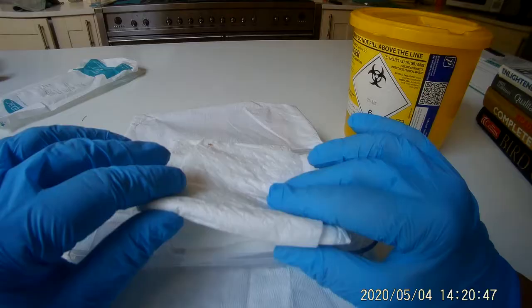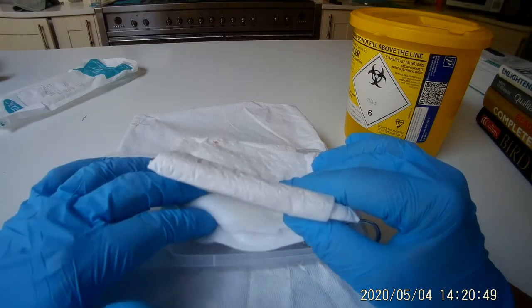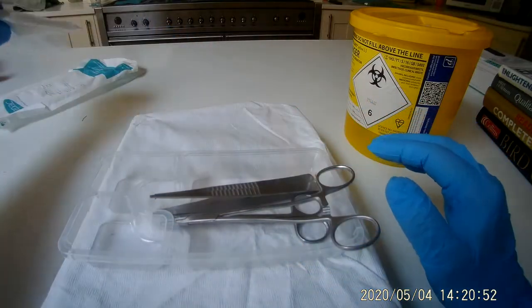Please remove the sterile drapes, gauze and gauze balls. Keep these for part two.